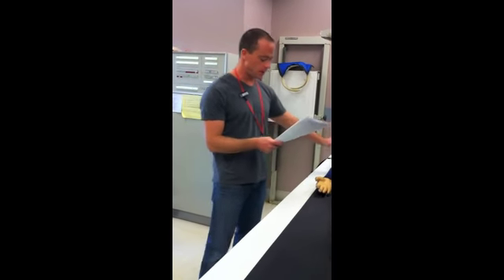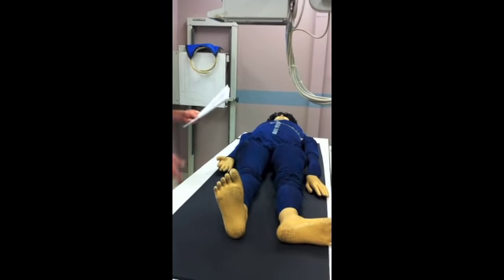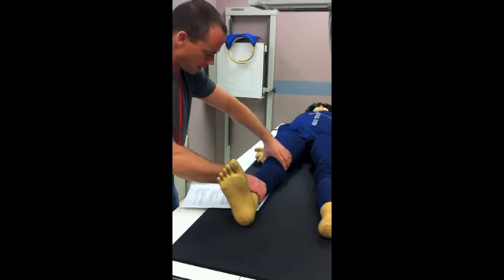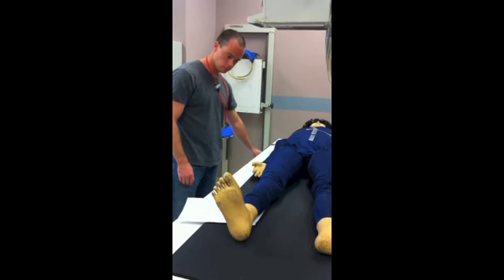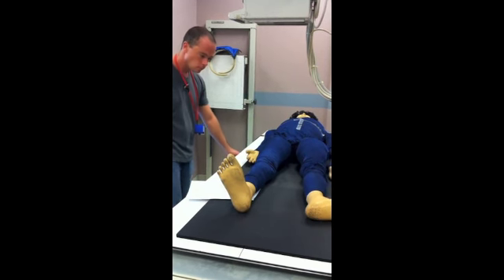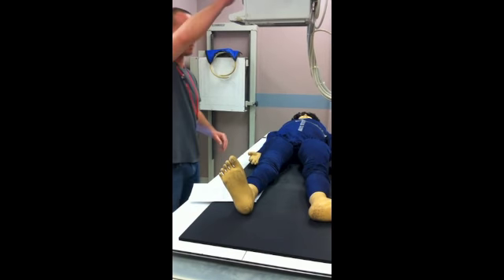The patient is supine on the table, pelvis not rotated. The IR is in the table bucky, and we need the femoral condyles to be parallel with the table. Okay.